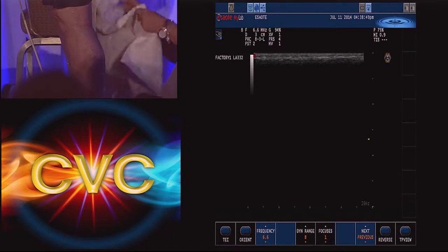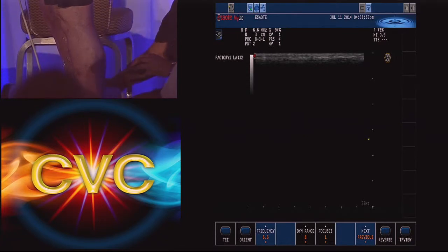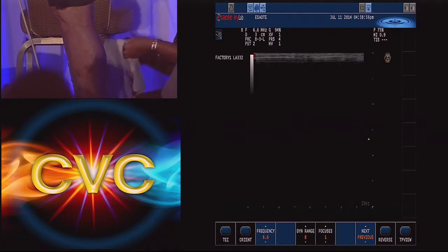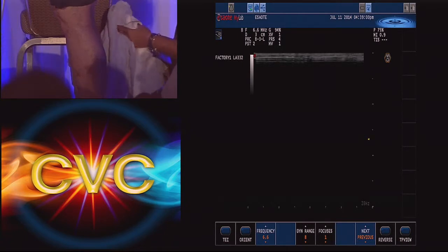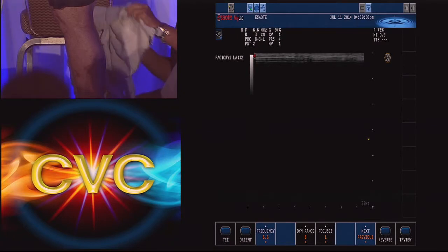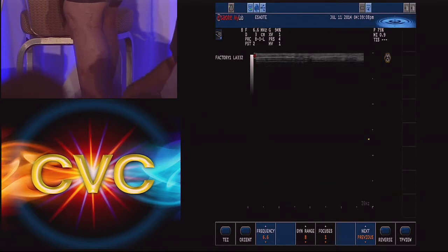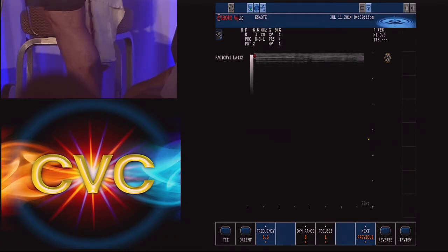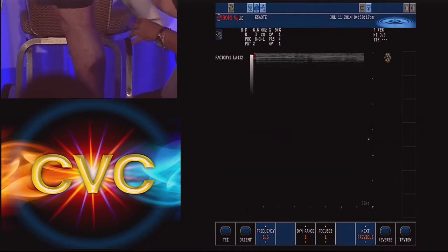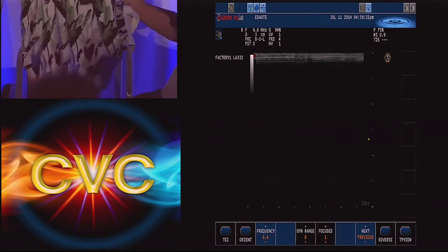No. If it's not damaged, if it's normal, why? Sometimes you don't get in. So then I would go from here up to here, or just take care of that perforator first and see what else is happening. It depends on what I see. If the perforator is the main thing leaking, I'll shut that down first and see what the benefit is. Because you don't want to overdo it, because the patient's going to suffer from that, and get the least impact. So I've seen patients who, like that reflux is only here, and they've shut down from here to here, and everything is still there.